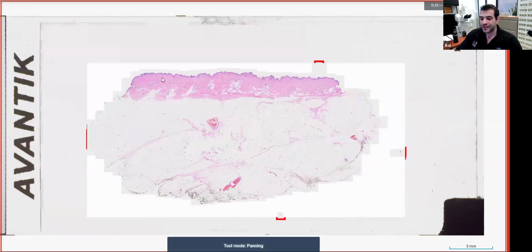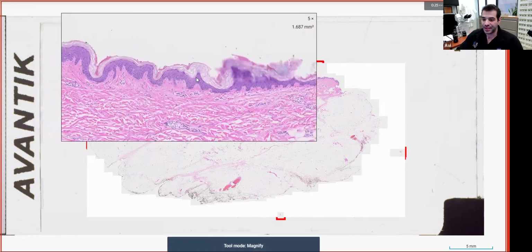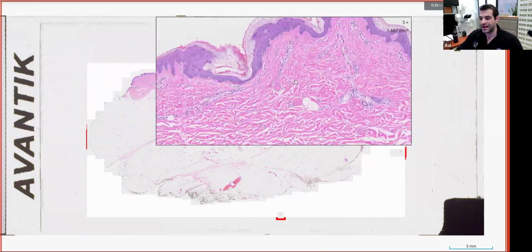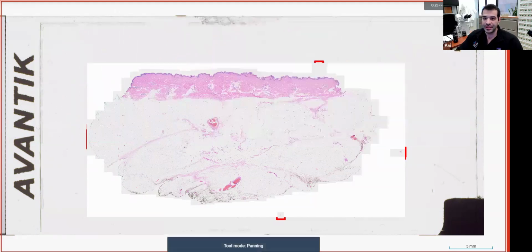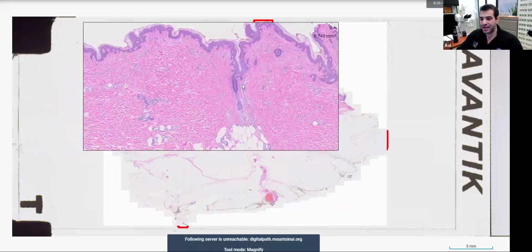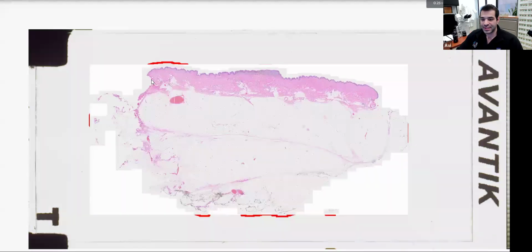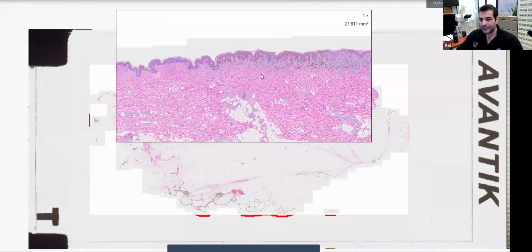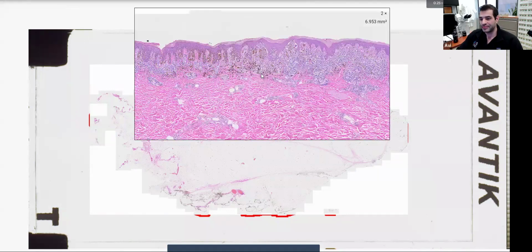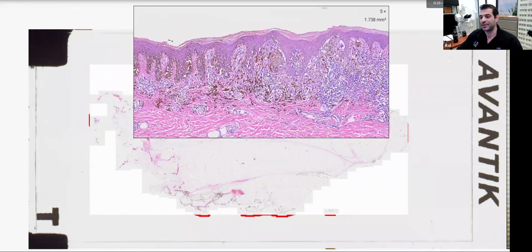Much more efficient. So just to show a quick overall about how this might work in practice, you see your slide, okay, it's an excision. You pan, you make sure you're not seeing your residual melanoma, not seeing anything, not there. Okay, very good. Keep going. Still not finding much. I'm panning, and again, not click dragging. Still panning. And here, I see something. And I can still zoom in. And now I see my melanoma.